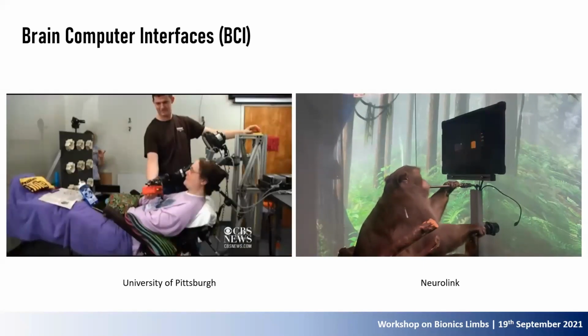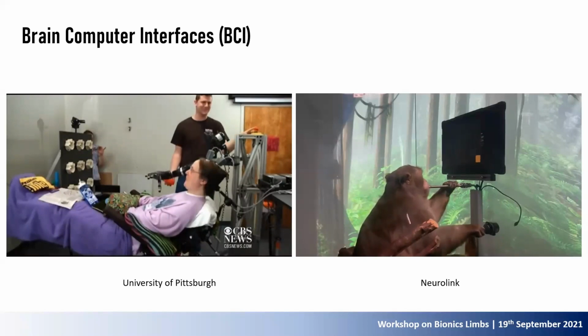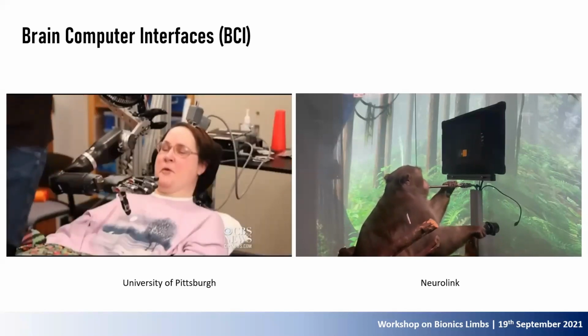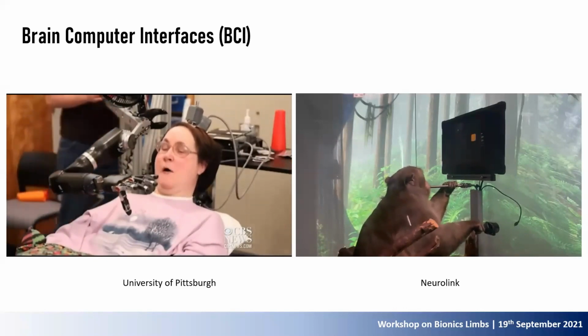Our goal is to enable a person with paralysis to use a brain-computer interface to control the game by its thoughts, or by their brain activity. This is really a fascinating outcome of BCI in the recent past. Because they wouldn't be able to move a joystick, they would calibrate this decoder by imagining hand movements.